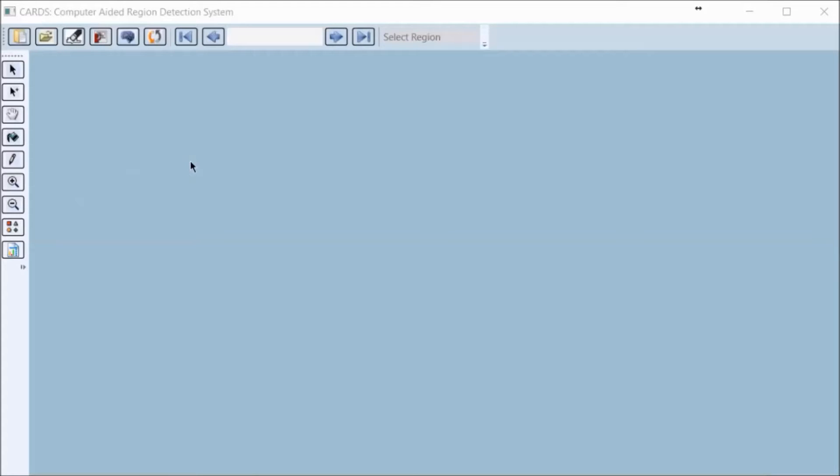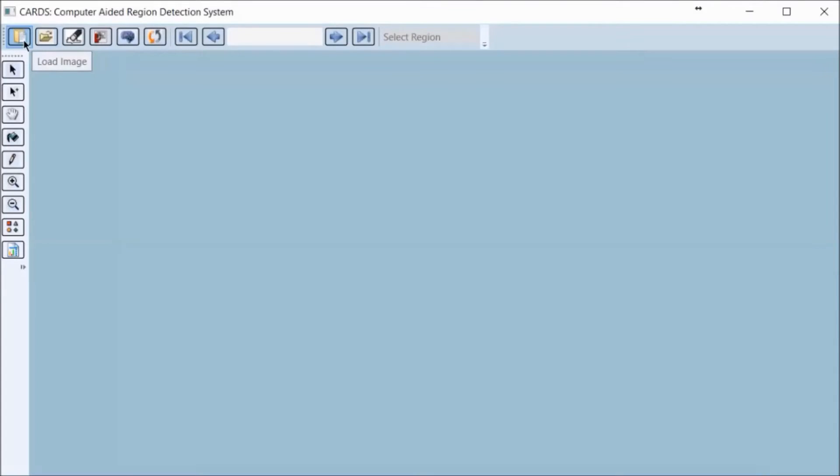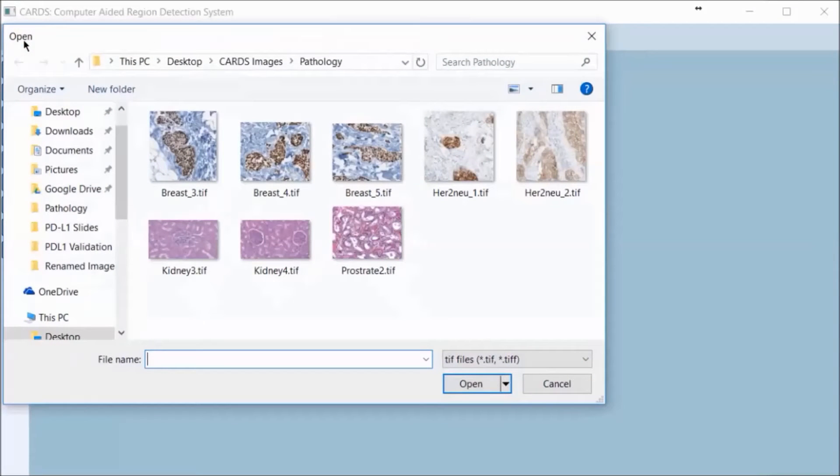CARDS, which stands for Computer Aided Region Detection System, is part of our Image Analysis Optra Assays platform. The application uses machine learning based algorithms to intelligently select and or reject regions of interest on scanned images.